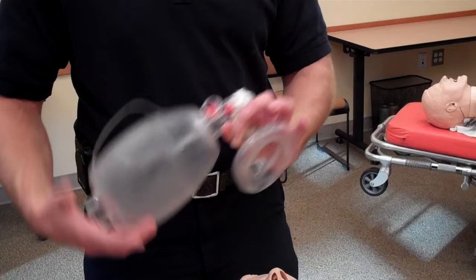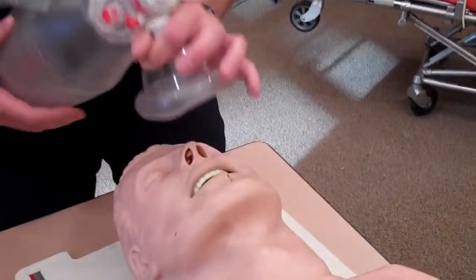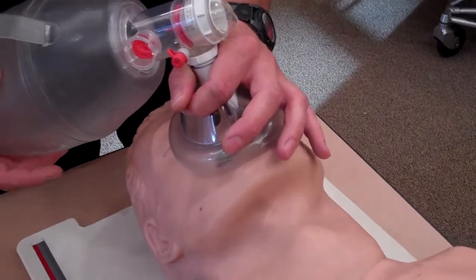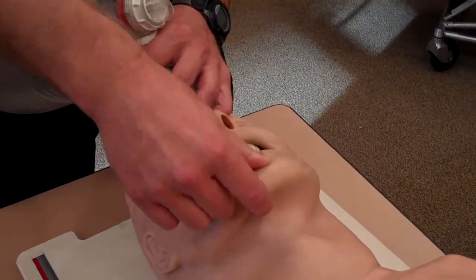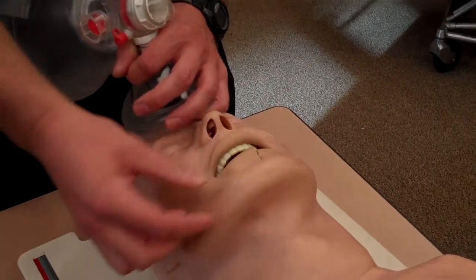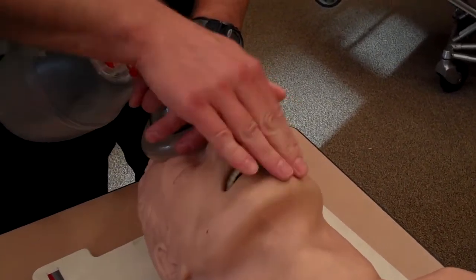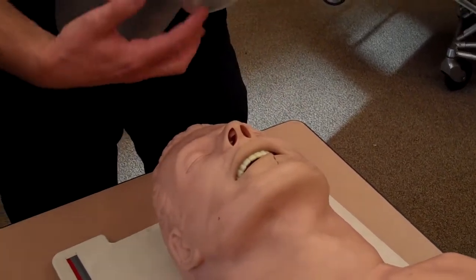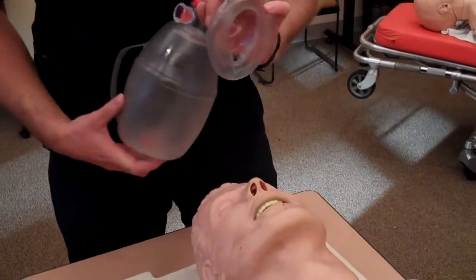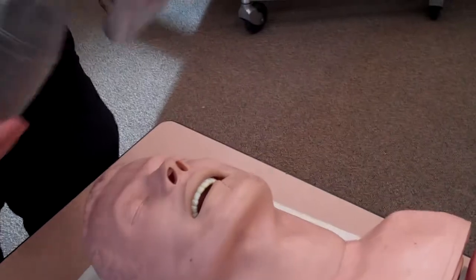From there, we want you to position the mask properly. Most people just place it ad hoc over the patient's face, or they'll aim for the mandible because it looks like an obvious landmark. Mandibles break, they move, and they can distort with trauma, so this is not an indicator of where you want to place your mask. What we want you to do is place the top of the mask up on the bridge of the nose and then pivot it down into position just like you're closing a door.